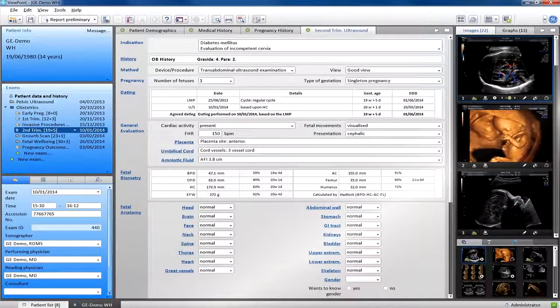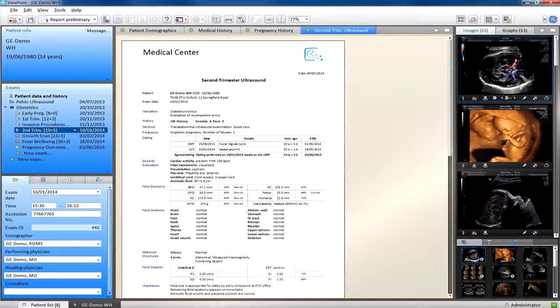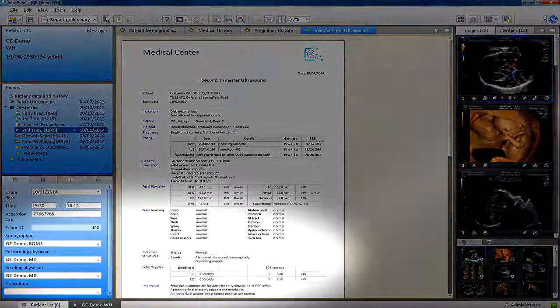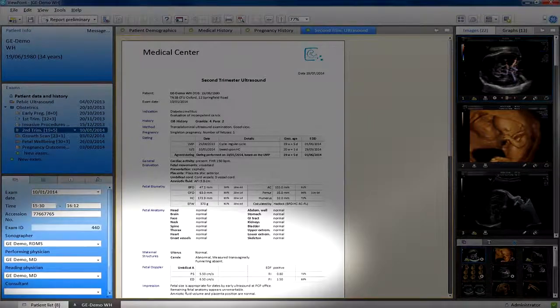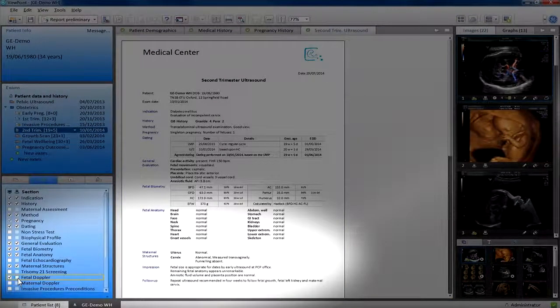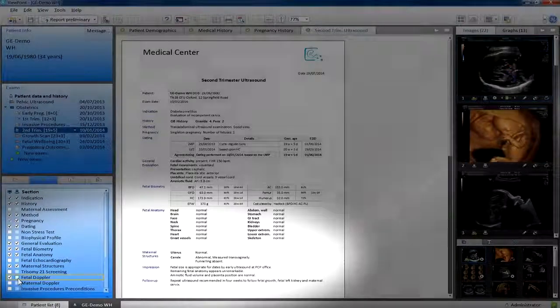Your referring physicians will be impressed by how clean and easy to read your reports are. And with just a few clicks, you have the possibility to customize your report to your individual requirements.